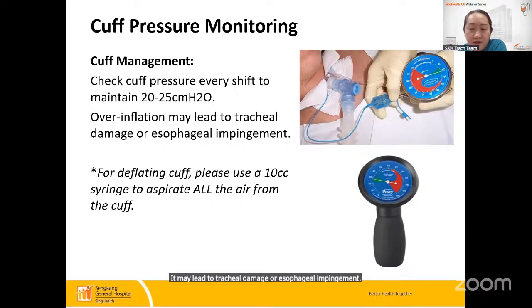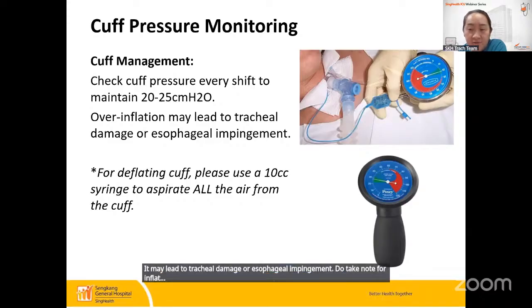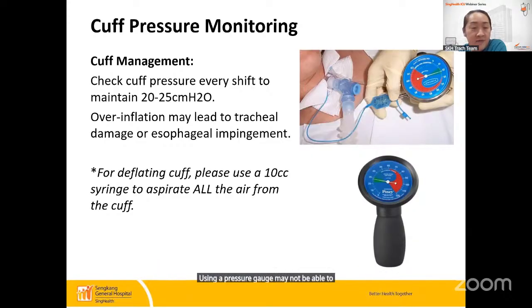Do take note, for deflating the cuff, use a 10 cc syringe to aspirate all the air from the cuff. Using a pressure gauge may not be able to deflate the cuff completely.